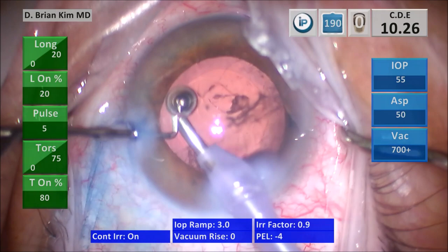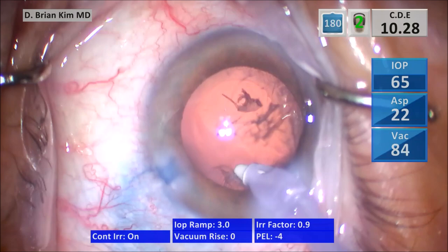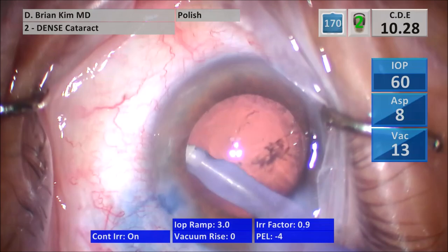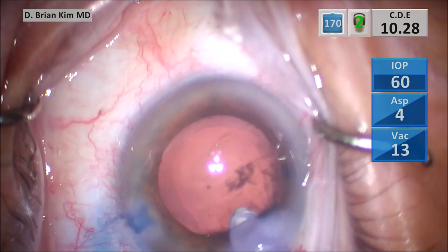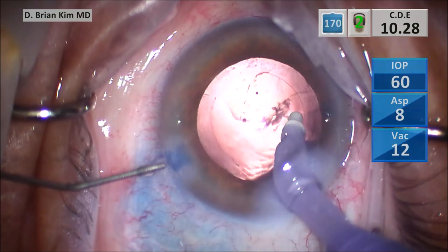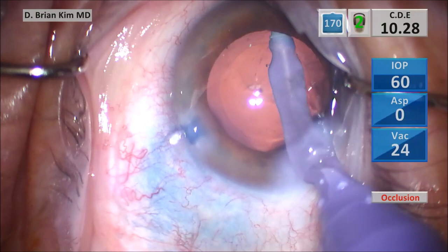I take the chopper out, go in with the BSS cannula, take the phaco tip out, and go in with the I&A handpiece. The tip was clogged three times in this very dense lens — possibly because I don't go pedal-to-metal with phaco, and since I really utilize mechanical fracturing techniques, that could make it a bit more challenging for the machine. However, I feel very confident this provides much clearer corneas. With these dense lenses, ever since I've employed mechanical fracturing techniques, my corneas have been very clear — especially in contrast to previously when I did a lot of horizontal chopping, which was a good technique but less predictable for corneal clarity. This way, I have very consistent corneal clarity by utilizing mechanical fracturing.